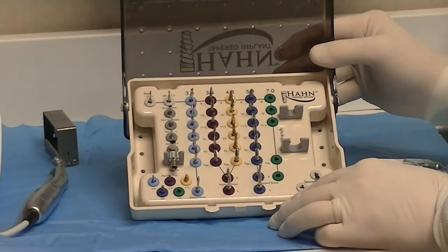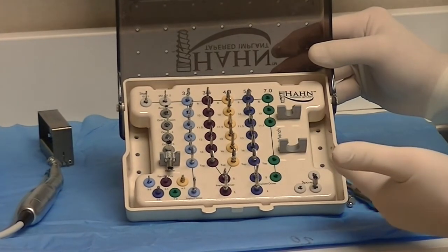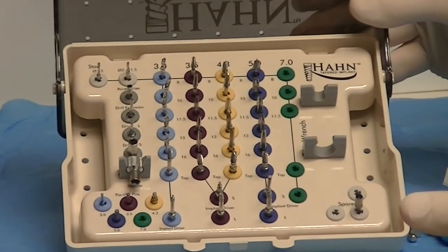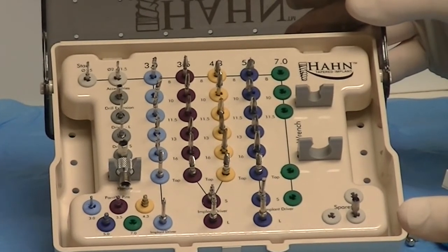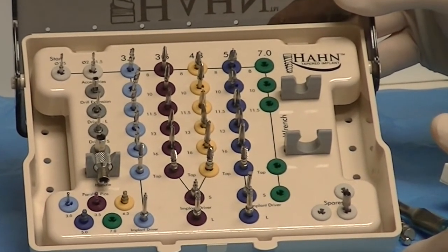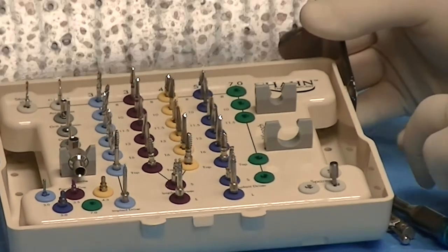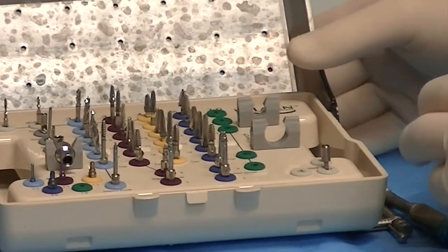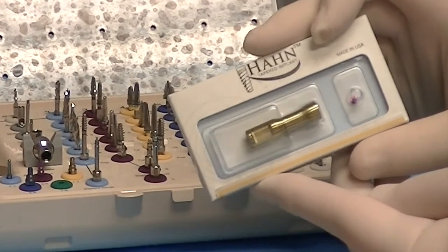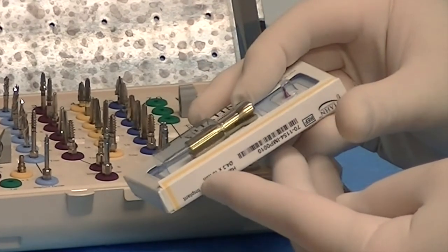The Hahn surgical kit is just an exquisite kit — very simple. What I like most about it is many other surgical kits have single burrs with markings on them, and doctors often have a very difficult time seeing the lines. The Hahn system from Glidewell Dental Lab has provided us a system of pre-measured burrs where the burrs are a different length and different diameters. The Hahn implant itself is pre-packaged sterilely and has all the measurements and recording devices.